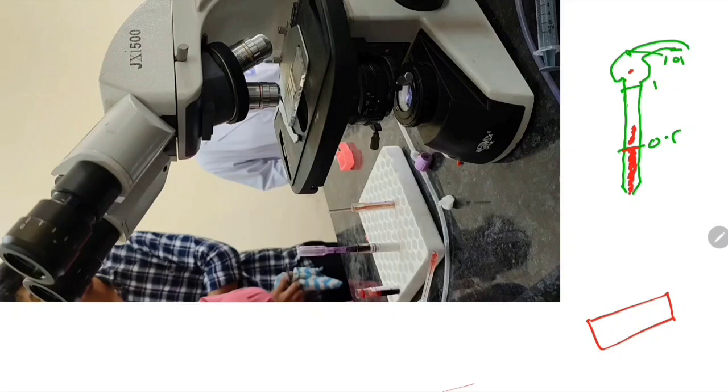So what we can do, we should take a hard surface, any hard surface or glass slide, and tap the tip of this pipette and take out the extra blood, and you will get the final volume of 0.5. Make it 0.5. Done. So first volume 0.5. Now again, we can take diluting fluid. Suppose this is the diluting fluid. Put your RBC pipette in the diluting fluid and take the diluting fluid.